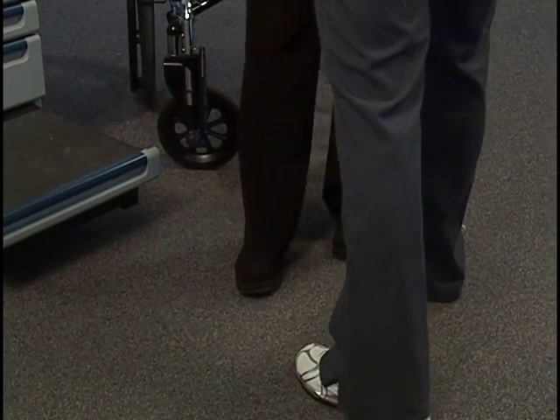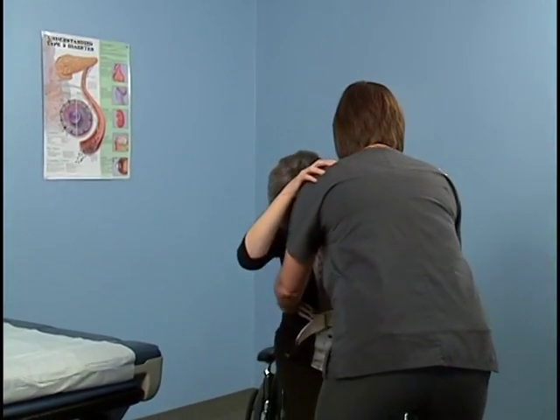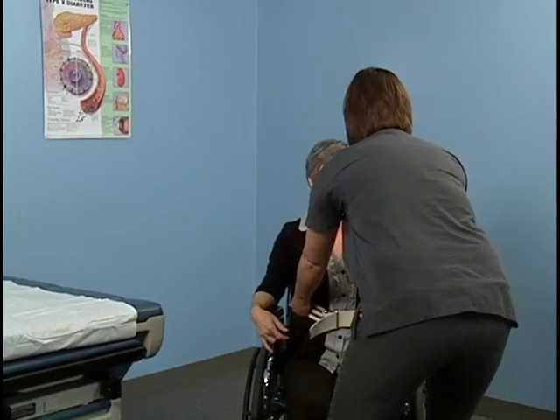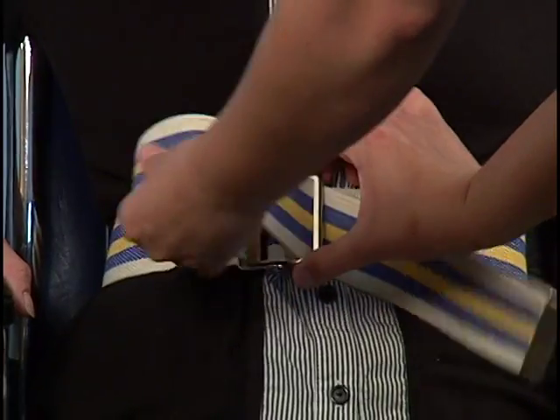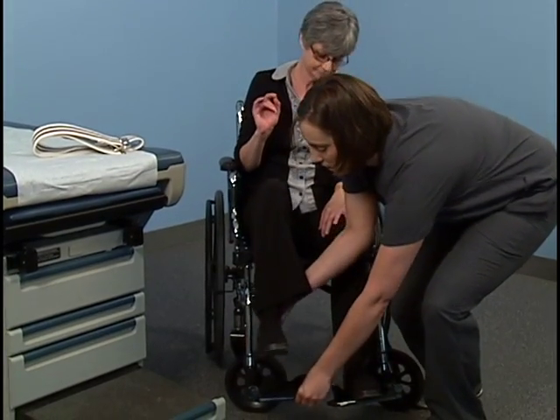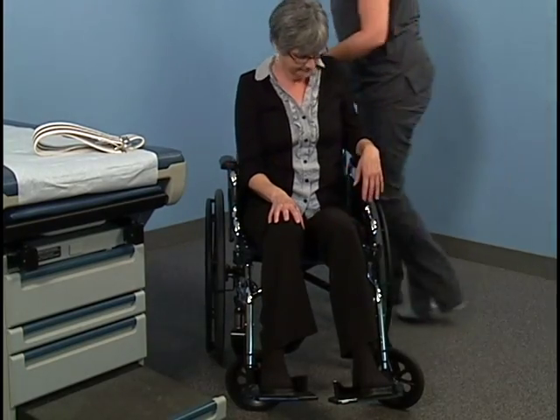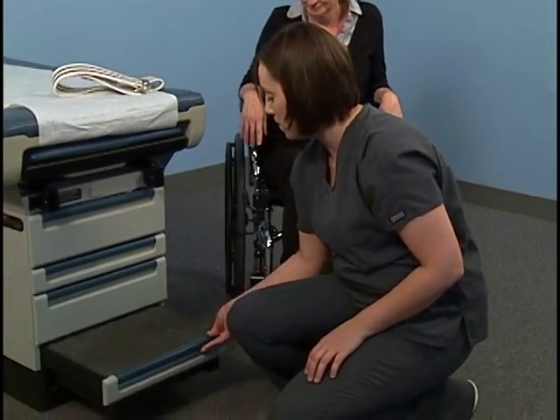Pivot the patient until the back of the legs are against the seat of the wheelchair. Bend your knees and gradually lower the patient into the wheelchair with the buttocks at the back of the chair. Remove the transfer belt and make sure the patient is comfortable. Reposition the footrests and help the patient place their feet on the footrests and unlock the wheelchair. Push in the footrest of the examining table.